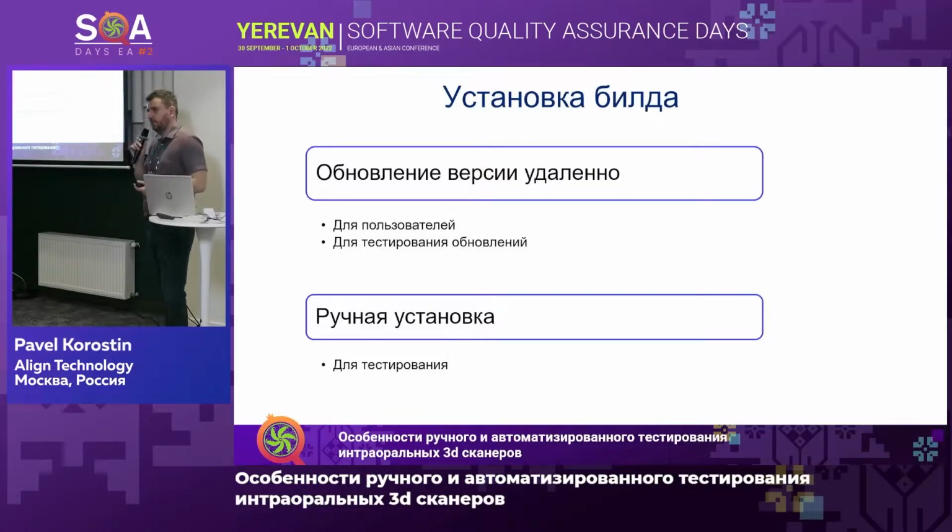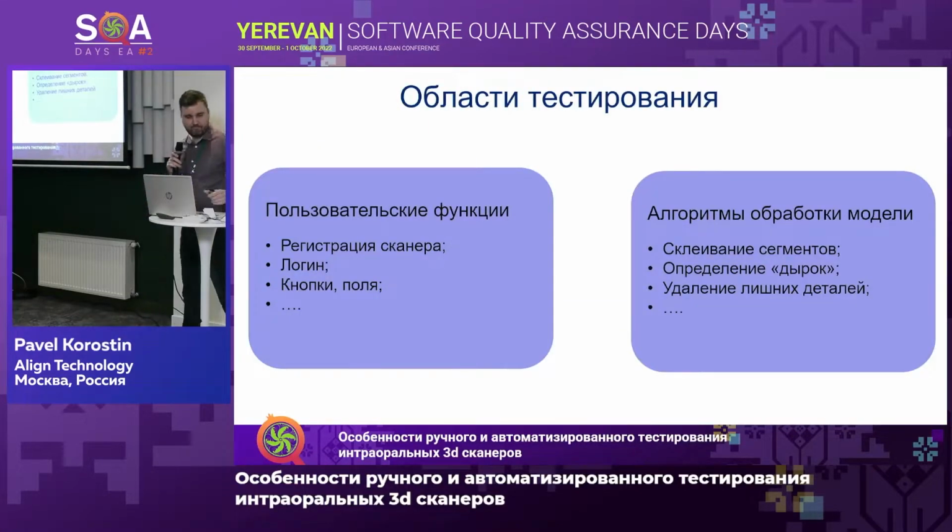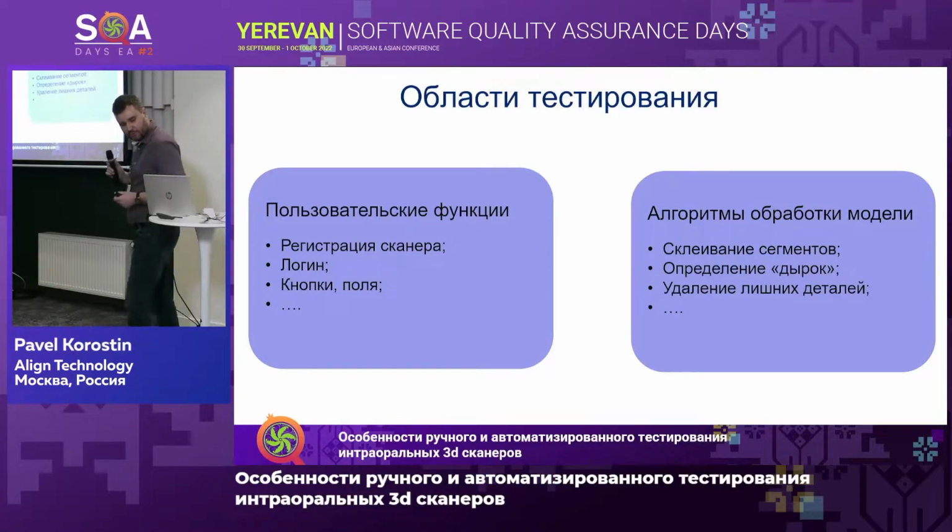The second one is manual. This installation is not that much different from any other software installation. You just launch the installer for the scanner and wait until it's done.